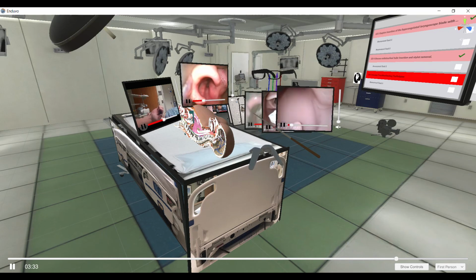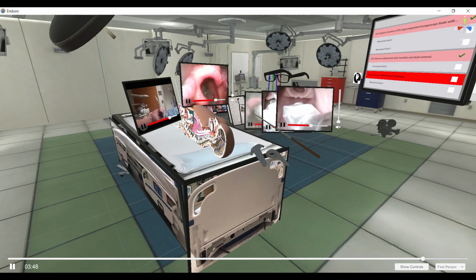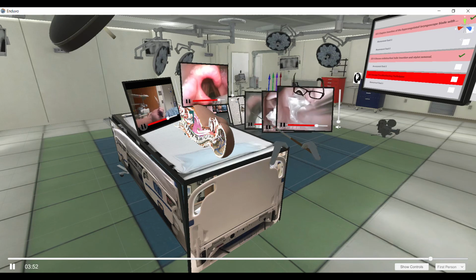Additionally, they did find themselves a little bit oriented to the right of the patient's tongue and airway. And by trying to stay midline with the hyperangulated video laryngoscopy blade, they would have potentially seated themselves in the vallecula at the beginning. So that concludes the troubleshooting portion of the lesson.